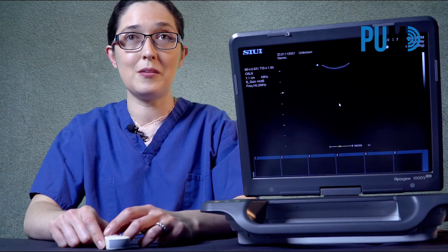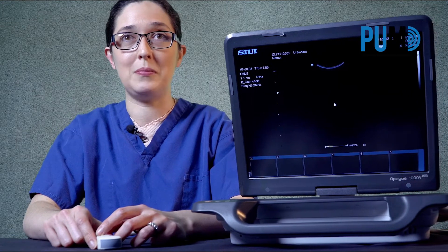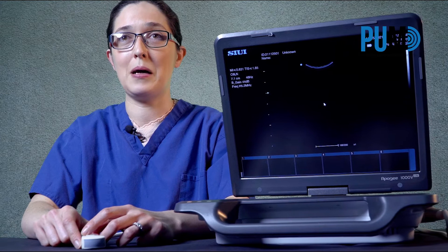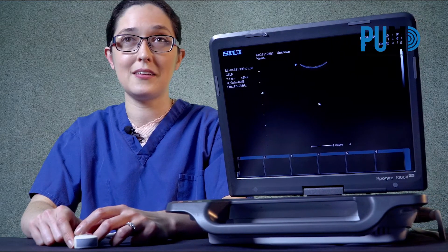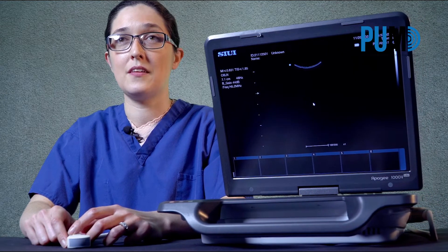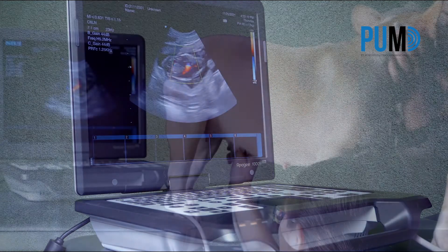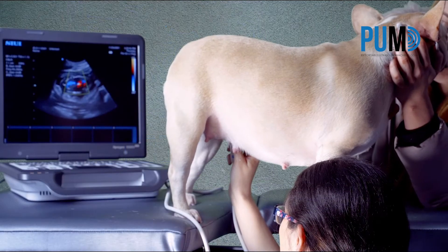There are too many systems out there now claiming to be colour doppler machines, but in real clinical practice the quality of the colour mapping is just so poor that it's practically useless. The colour flow on this machine is clean and accurate and it outperforms anything else I've seen below £10,000.